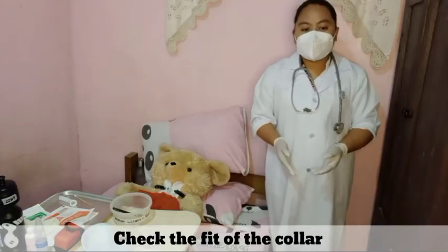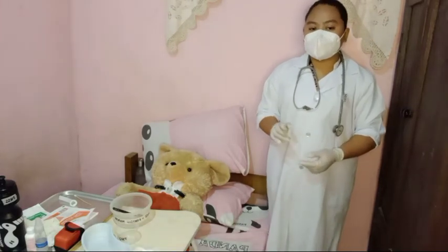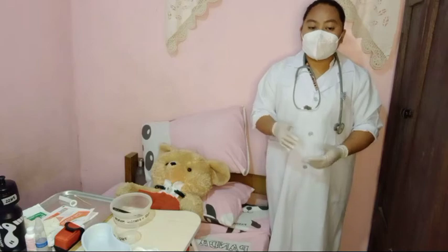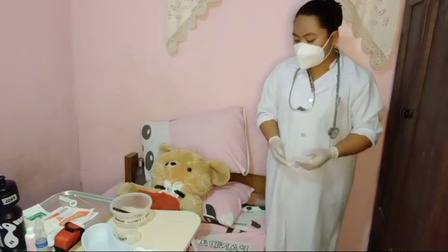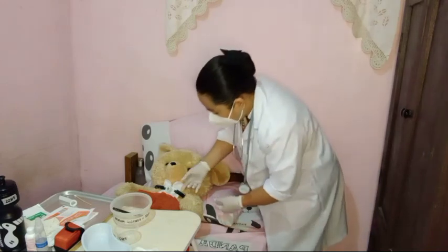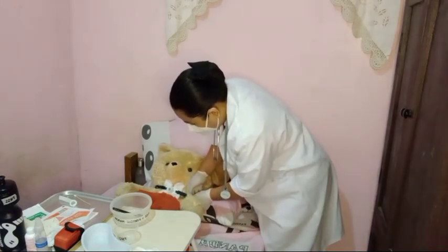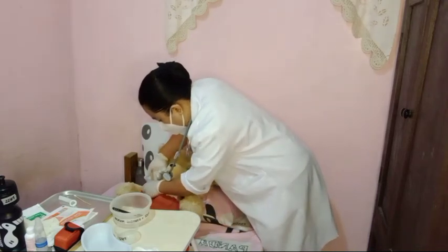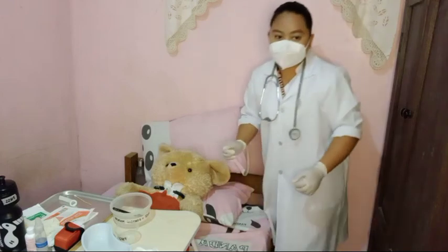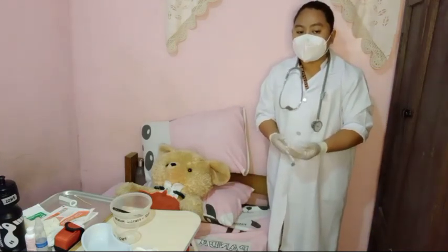Then check the fit of the tracheostomy collar. You should be able to fit one finger between the neck and the collar. Check to make sure that the patient can flex the neck comfortably. Then reapply oxygen source if necessary.